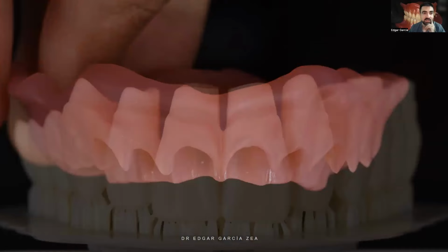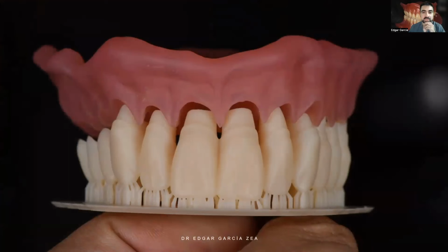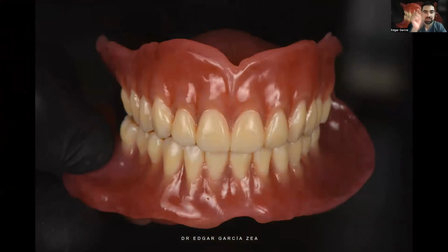This is printed in your office. Exactly. This is printed: the base, the teeth, and we cement them. And after that, you can modify it with some characterizations, with tints. These are called the tints and opaquers. I think that GC America makes a very nice tint for characterization of dentures.